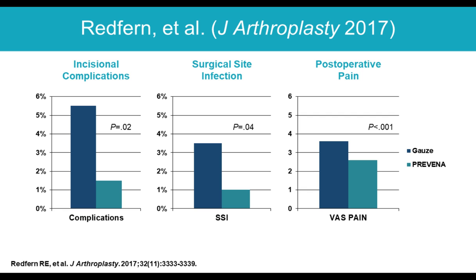And the investigators here found significant improvements with the negative pressure dressing with respect to incisional complications and surgical site infection, and those 2 things are probably not surprising given everything that we've talked about. But the one surprising thing in their study is that they found a decrease in post-operative pain in patients treated with the negative pressure dressing compared to the dry dressings.